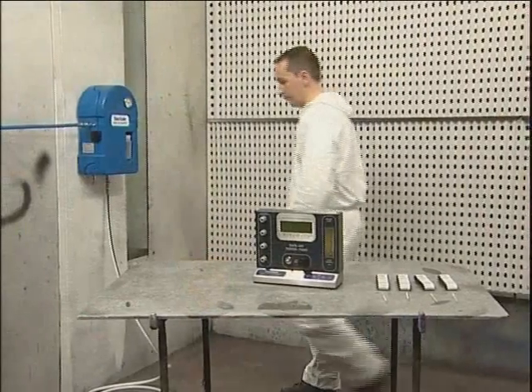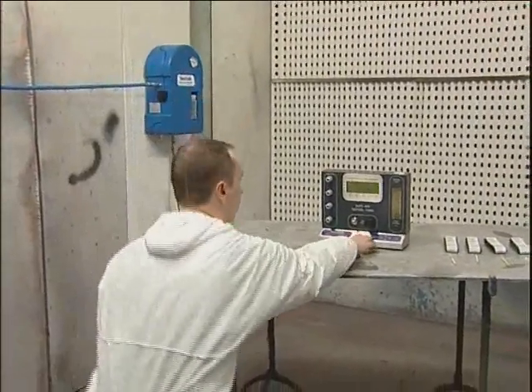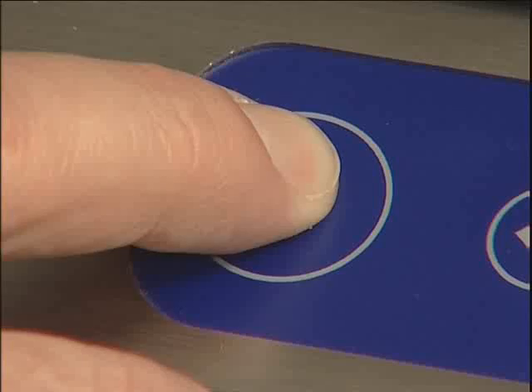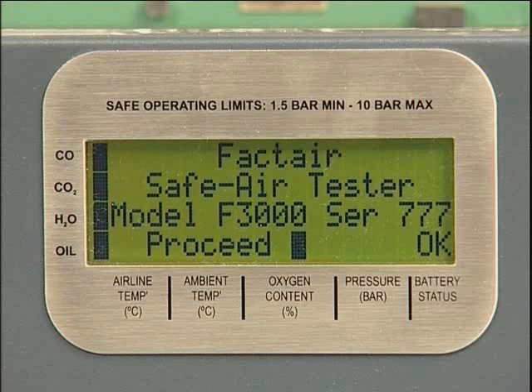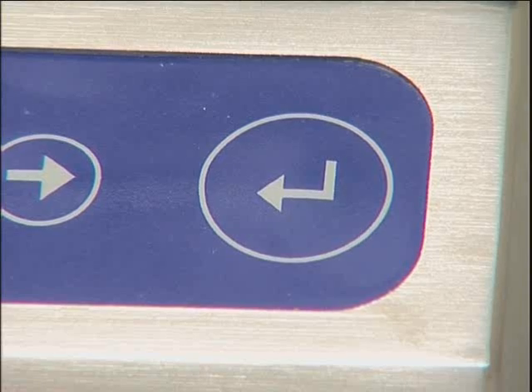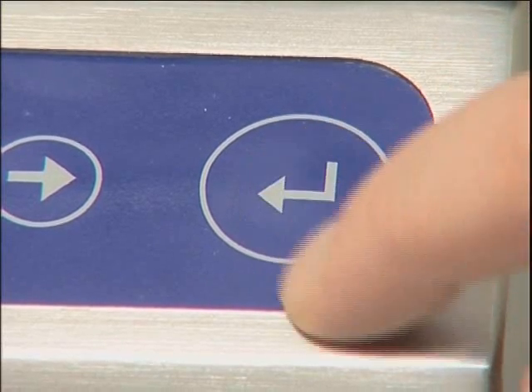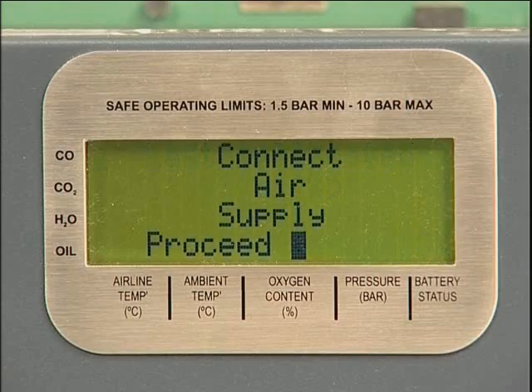To carry out a test, first switch on the machine by pressing and holding the on/off button on the keypad for approximately two and a half seconds. The display will show both the model and serial numbers. If the battery's condition is OK, press enter. Press enter again to acknowledge the date of the last calibration.